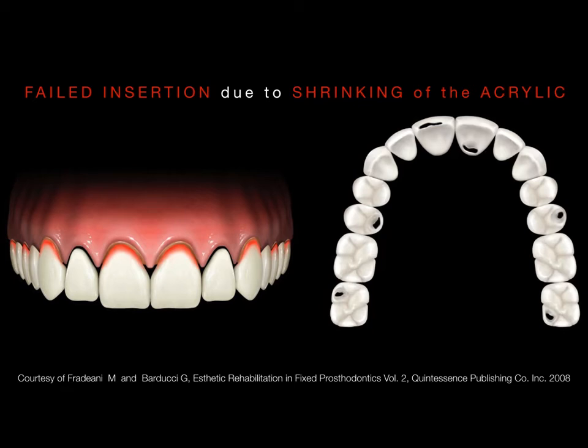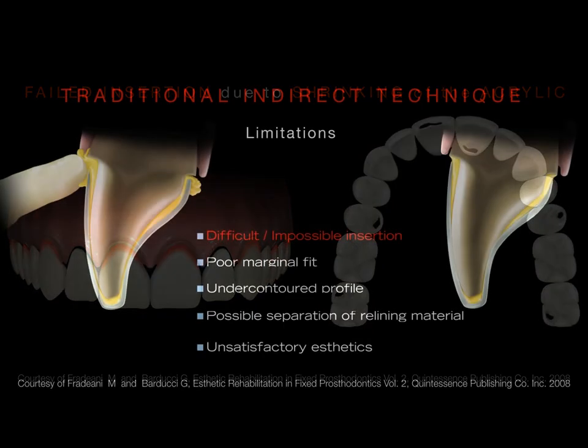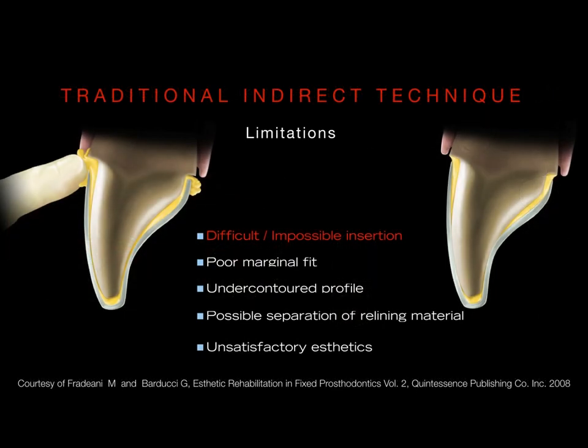It does create a very difficult situation for the clinician, who at this point cannot really create a very nice provisional that can be copied to the final restoration, because it is maybe completely inclined on one side or completely broken. So what is the limitation of the traditional indirect technique?